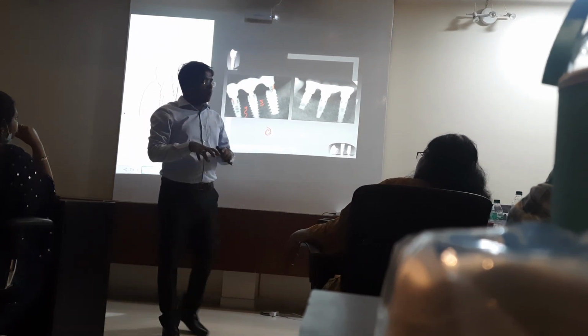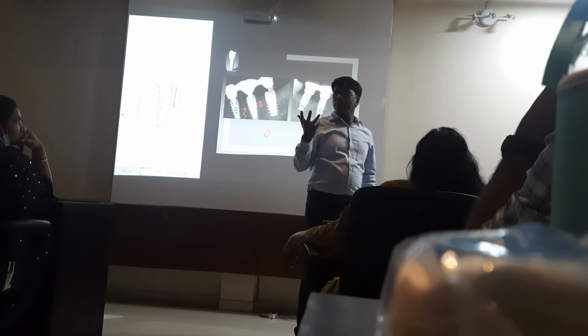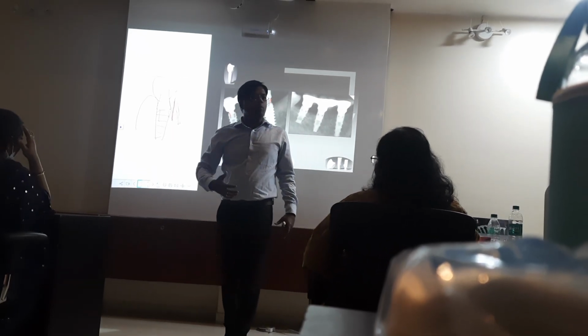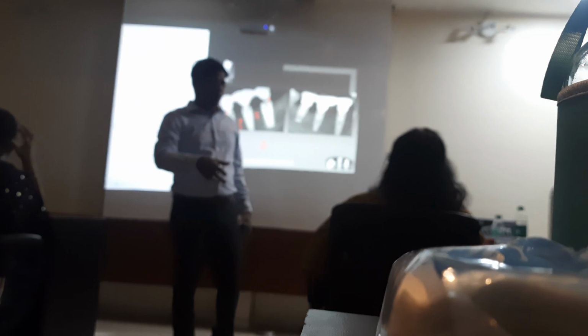do you know all the posteriors we give an access hole on the crowns? Normally in our tooth and bridge crowns, we don't give any holes. But in implant crowns, irrespective of the company, whether it is Nobel Biocare or Straumann, there will be an access hole. Why that access hole? Now we say retrievability. But in those days, why retrieve? Mainly because the problem was screw loosening. So if at all screw loosening happens, how to tighten? That hole will give you access.